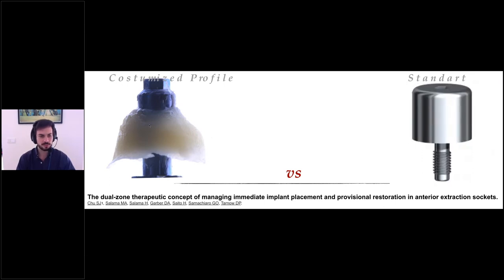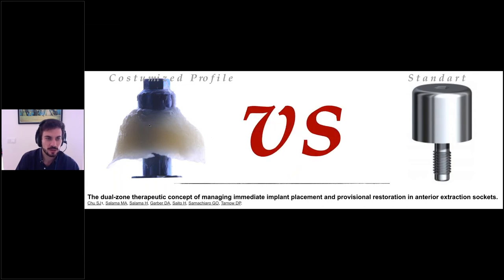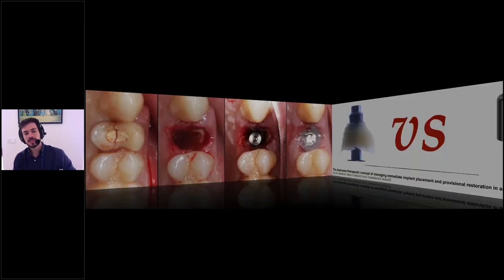We know from the studies on the dual zone concept that the best results are obtained when we graft the dual zone and we use a provisional restoration or a customized healing abutment. So let's see some cases here.